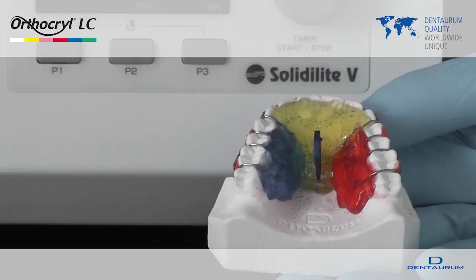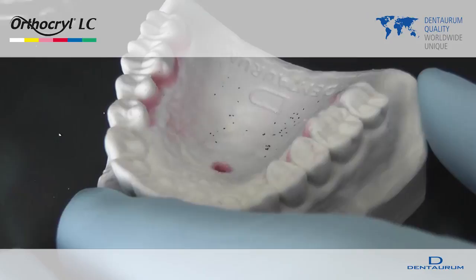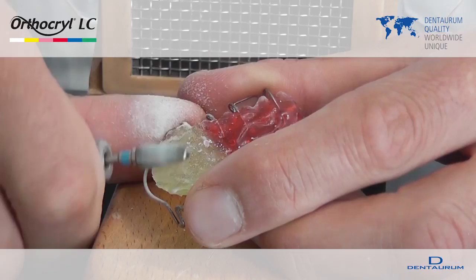The air inhibition layer must be removed using a cleaning liquid after curing. Appliances made with OrthoKryl LC are finished in the same way as with OrthoKryl cold polymer material.